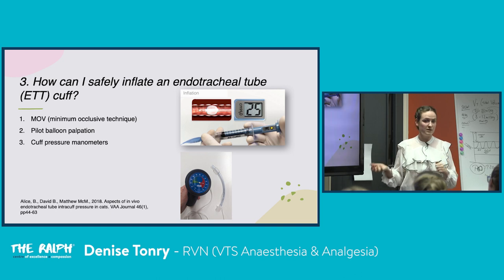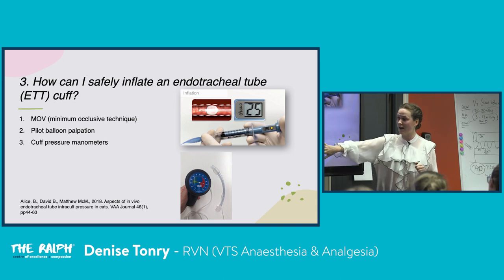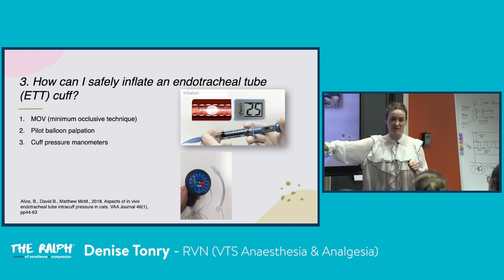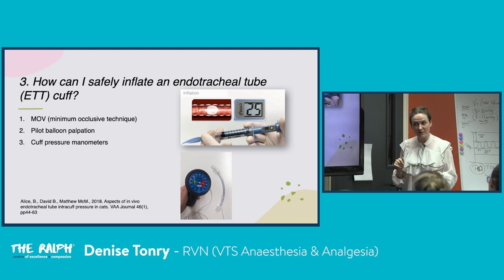You can bring it clinically straight away. Now when we still do the minimum occlusive technique, we do not have enough of these to anaesthetize 20 patients a day and have it in every tray. But as I do it, I know now I just give less pressures. And when they're like, I don't hear a leak, I'm like, great, we'll stop there. Because the chances of us having achieved a significant enough cuff is quite high.